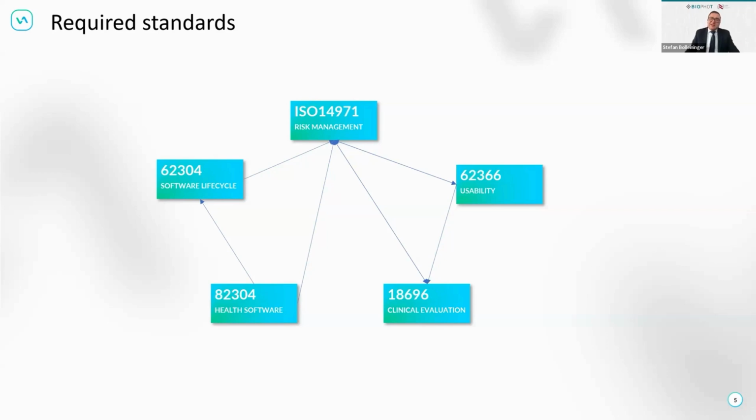There can be particular product standards which you can use and get more information from, like if you use, for instance, an app which is created for face screening, and from the face screening it can create the blood pressure or the insulin values.